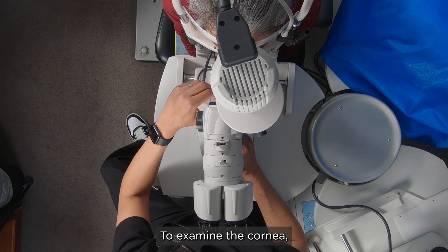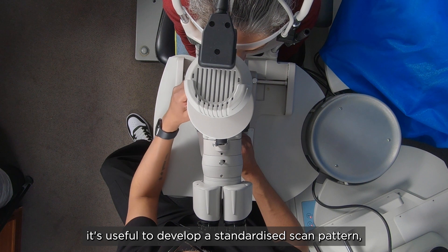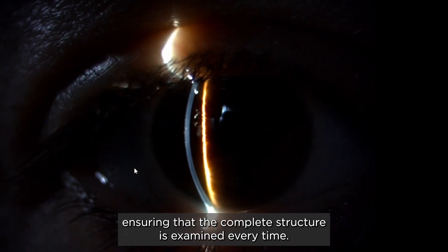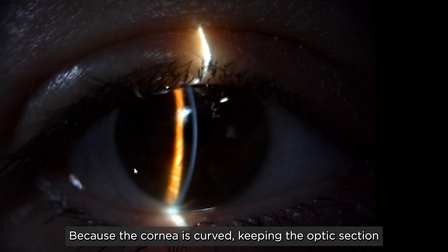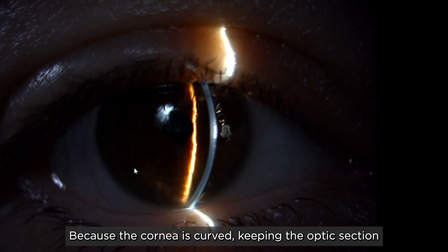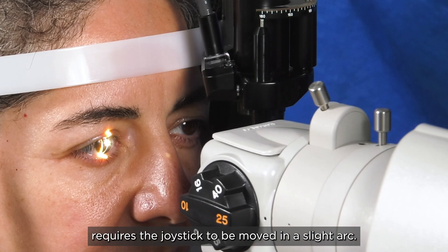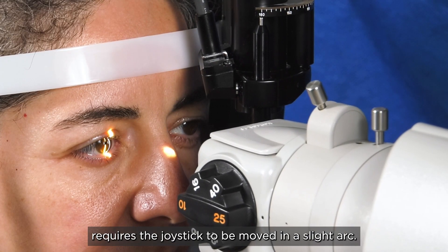To examine the cornea it's useful to develop a standardized scan pattern, ensuring that the complete structure is examined every time. Because the cornea is curved, keeping the optic section sharply in focus while moving the slit across the cornea requires the joystick to be moved in a slight arc.